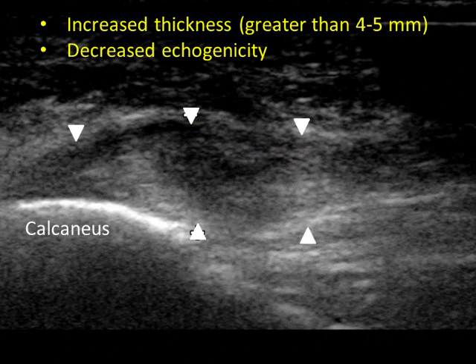Fascia thickening greater than 4 mm and decreased echogenicity establishes the diagnosis of plantar fasciitis. Hypervascularity of the fascia and the adjacent soft tissue on color Doppler implicates acute plantar fasciitis. In severe cases, partial tear or even complete rupture of the fascia can be observed.